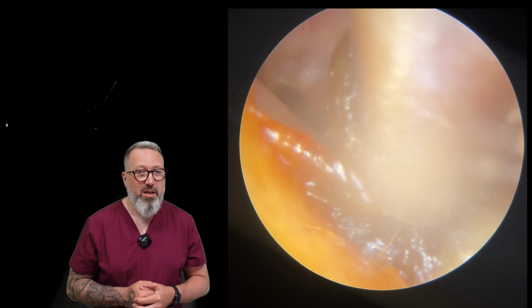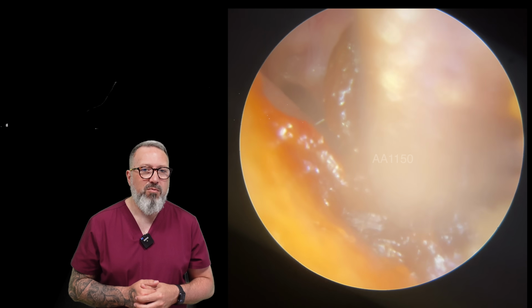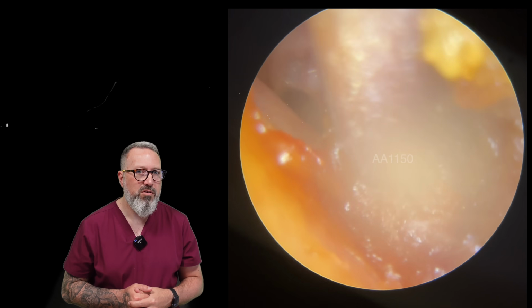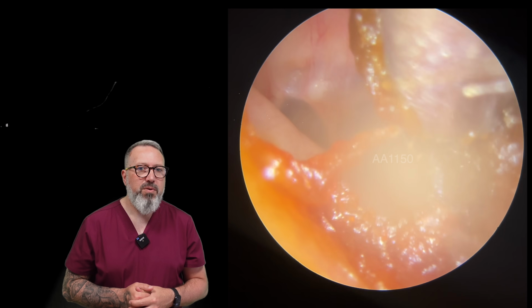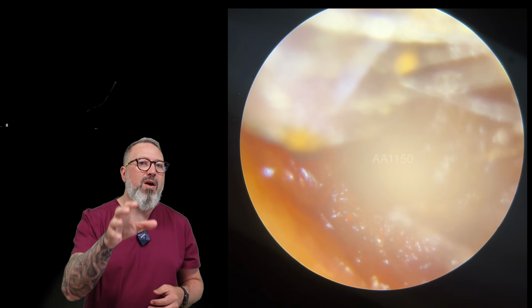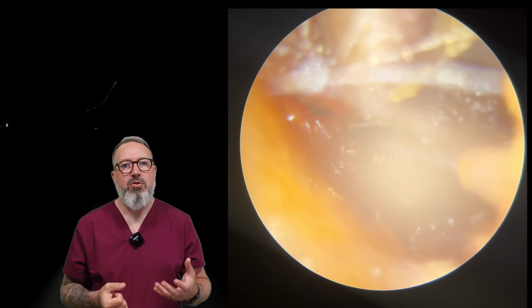Patients will normally opt to have it removed, just because they don't like the idea of having any wax inside their ear canals. But this really wouldn't be causing any problems as far as the day-to-day hearing for this particular patient. So just peeling around the outside edge. You see it's a little bit harder on this side because the wax doesn't have the same hard consistency as it did on the other side.